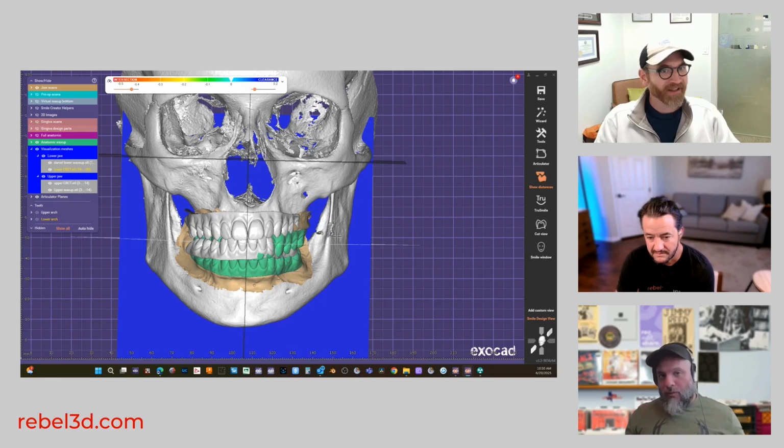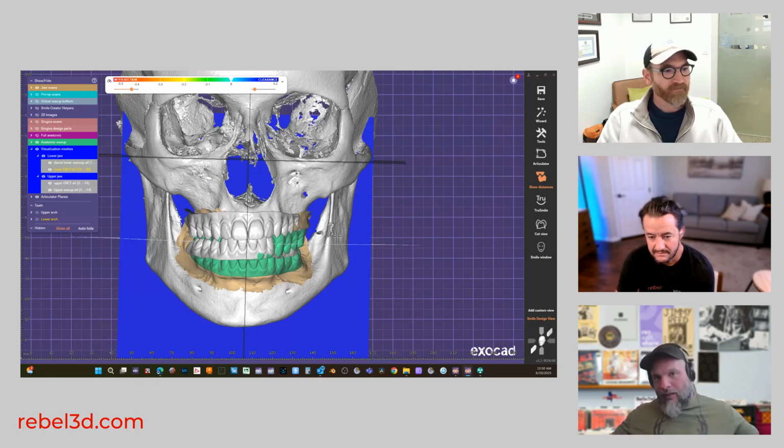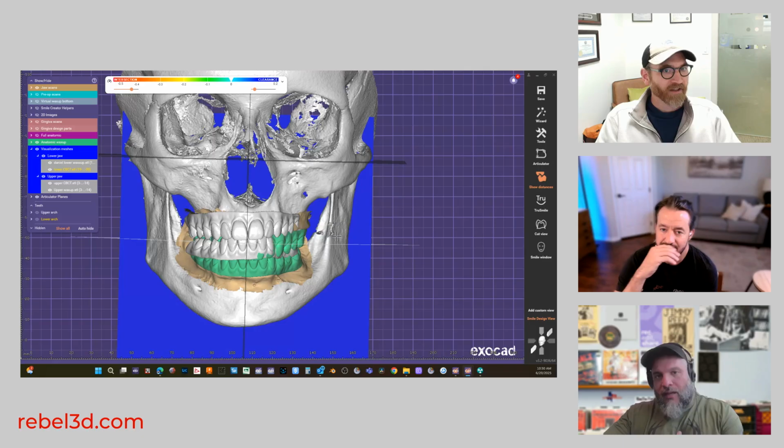And for the most part, in my experience, that's like 1 out of every 100 scans where you actually see the teeth correctly. Otherwise, it meshes the shape of the teeth weirdly, and so you can't even properly align your scans to it. I think they add more problems than they solve, but it's a great selling point for the doctor. Like, look, I'm a high-tech doctor. Look, I can scan your face and all that, but yeah, as a designer, I don't see the benefit of a face scan personally.